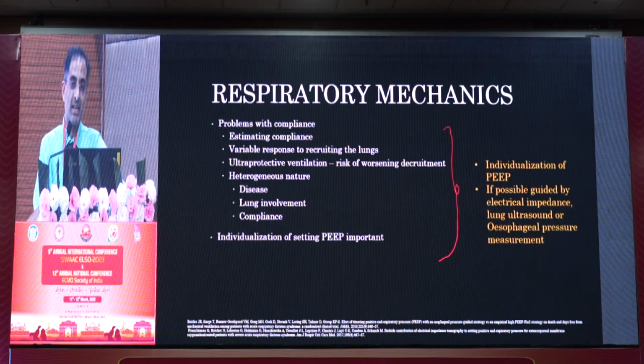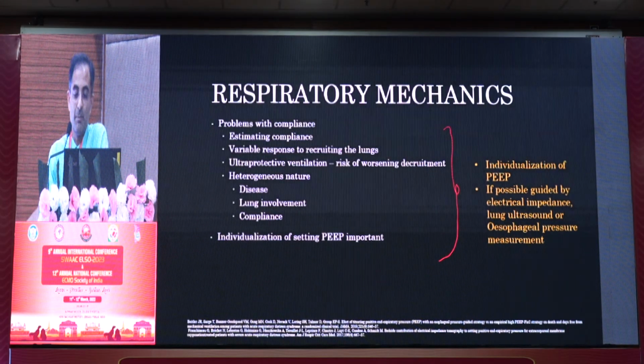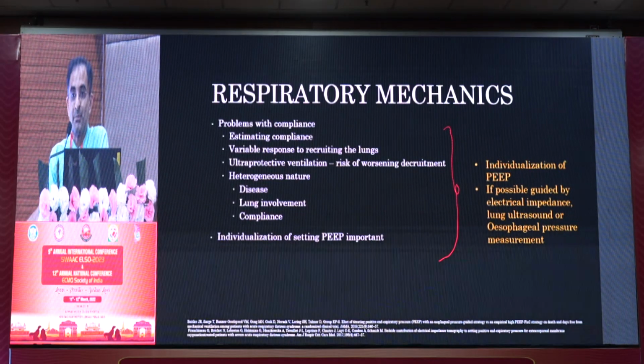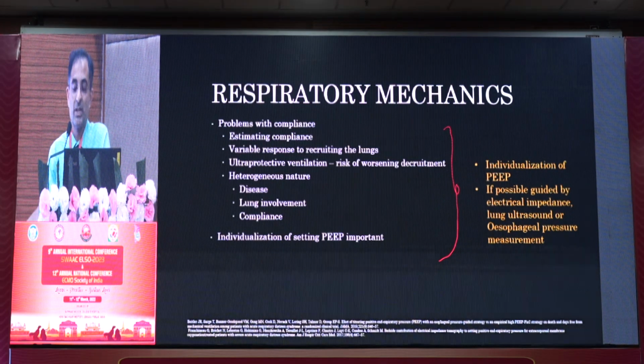So hence, as we know, individualization of PEEP is extremely important, and we have moved from the days of a make-to-fit-all order to what we call individualizing PEEP. I won't go into the details of that, but the same methods that we use to individualize PEEP or ascertain what is called an optimal PEEP for a given patient can be used in those patients on ECMO as well. Of course, we have the luxury of the ECMO here, so it's much easier to ascertain the optimal PEEP in these circumstances.